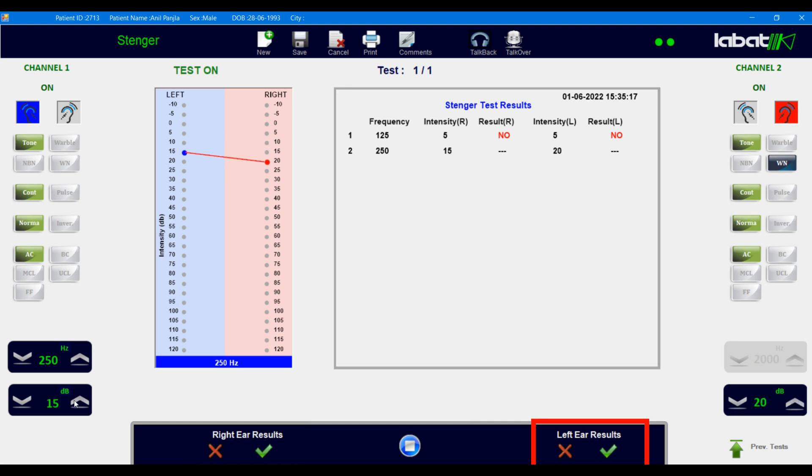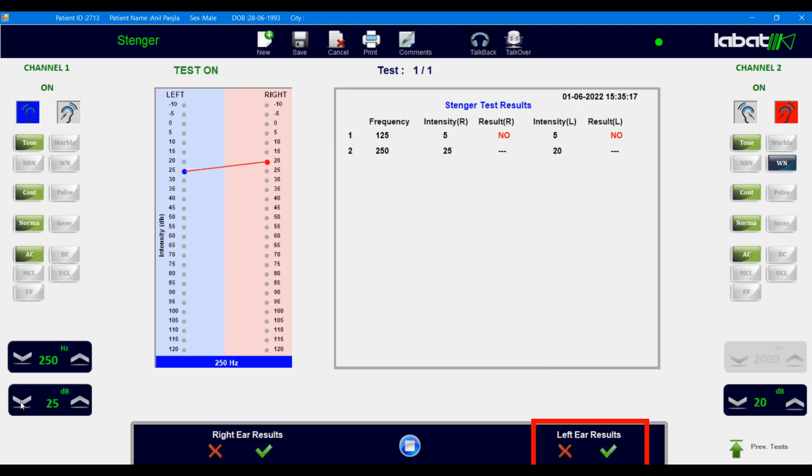On left ear result, click on Yes if patient hears the stimulus, or click No if patient cannot able to hear the stimulus.